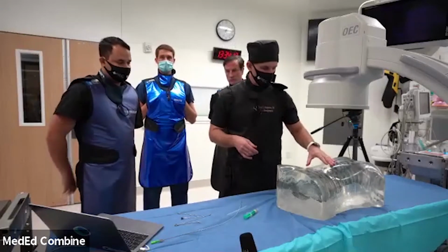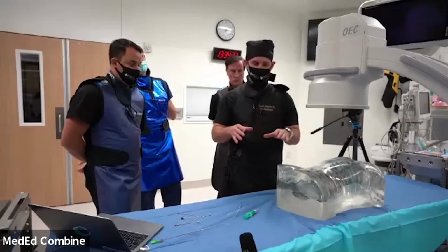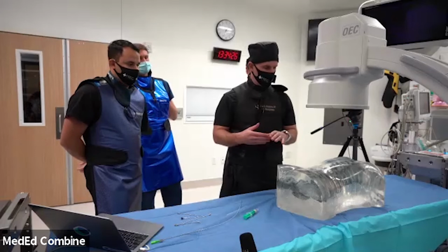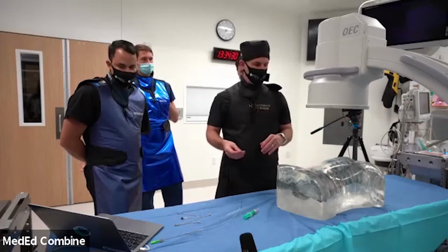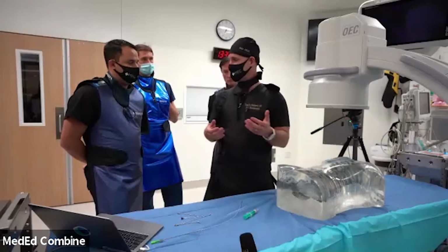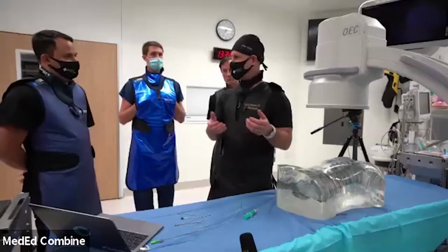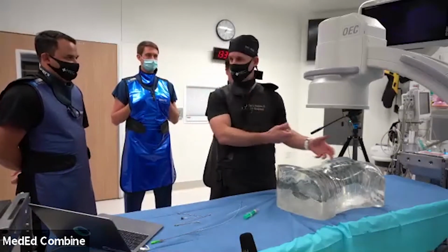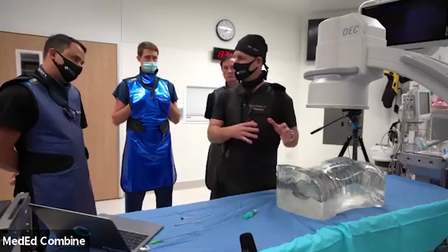So again, a lot of effort has been made to recreate the LOR, which was outstanding. It was a little hard to advance the lead and we'll work on that. But I think that's probably just a matter of this being the very first time we've used this. When I go to labs, it's funny, I'll teach somebody how to do an LOR, and then everybody after them can LOR from across the room, right? Because their resistance loss is like the whole space is wide open. So I think we're still getting a good feel on this.